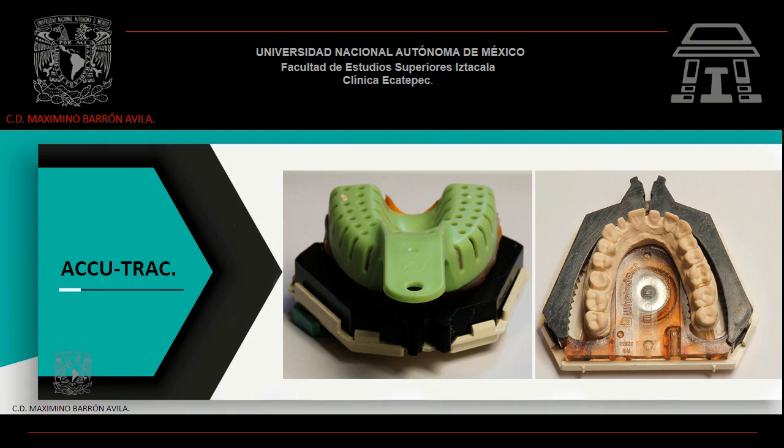El sistema ACUTRAC hace más fácil la fabricación de modelos de precisión y troqueles de trabajo separados. El fabricante sugiere que el modelo y la base se vacíen al mismo tiempo, con la finalidad de ahorrar tiempo y material sin sacrificar precisión.